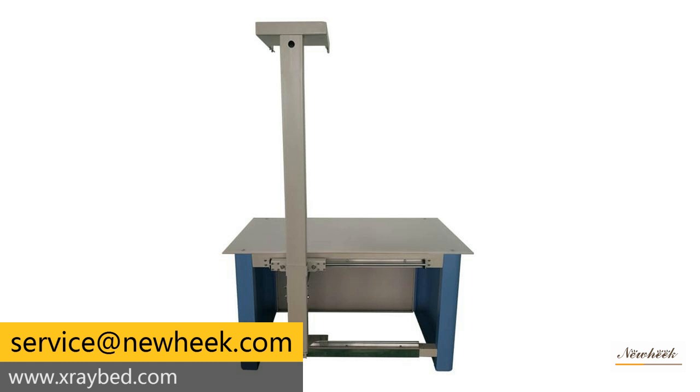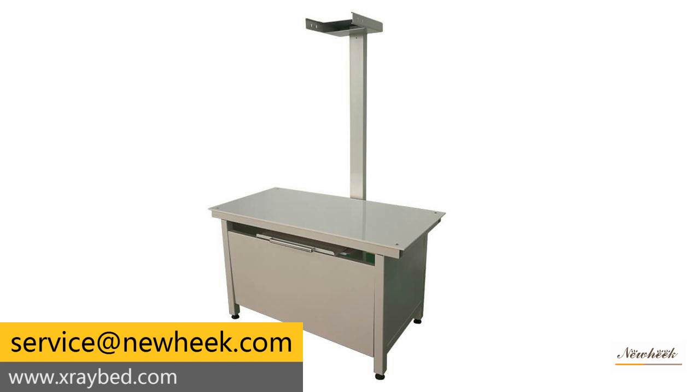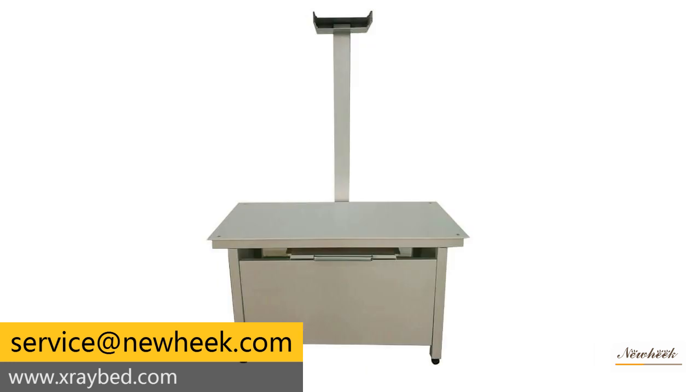The veterinary x-ray table has a wide range of types, including fixed, mobile, and four-way floating x-ray tables. There are veterinary x-ray tables with and without bucky, and bedding materials can be customized. Newheek veterinary x-ray tables can meet your different purchase requirements.